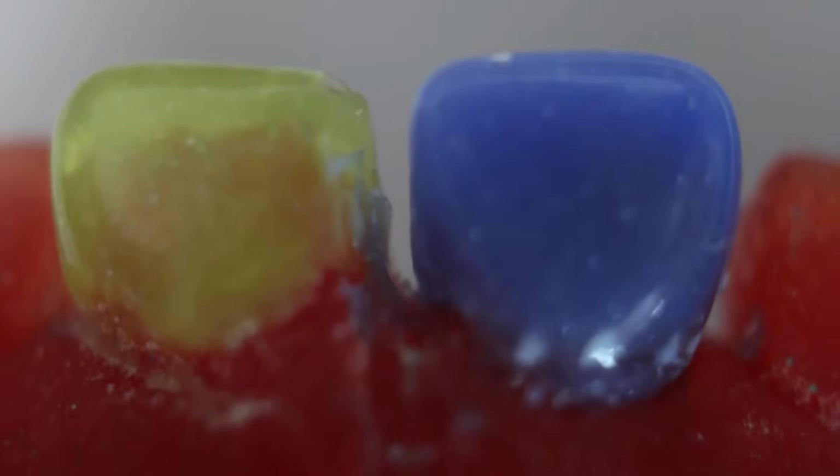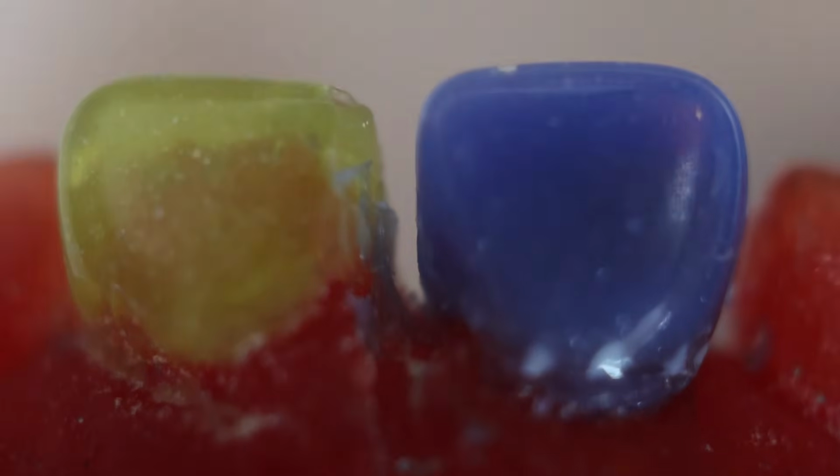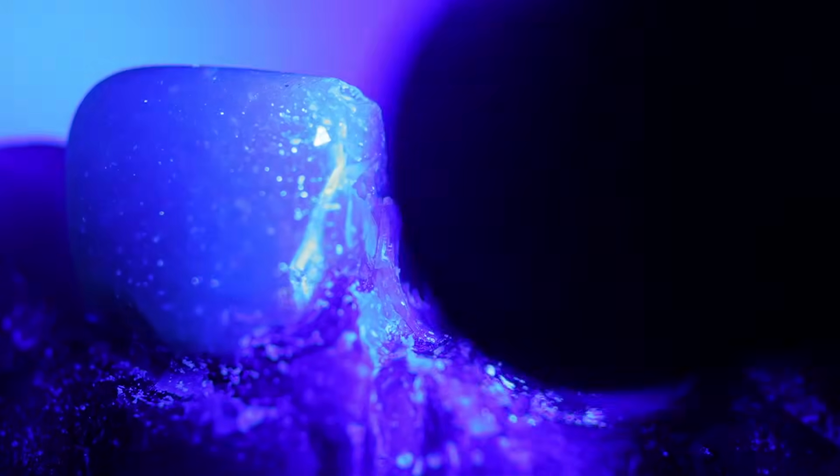And now let us cure it. Curing for roughly 40 seconds is enough from both the aspects.